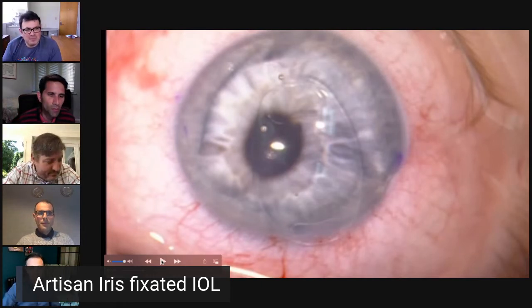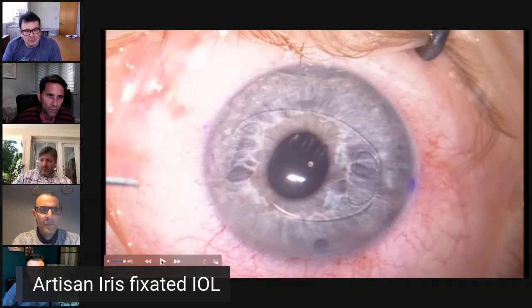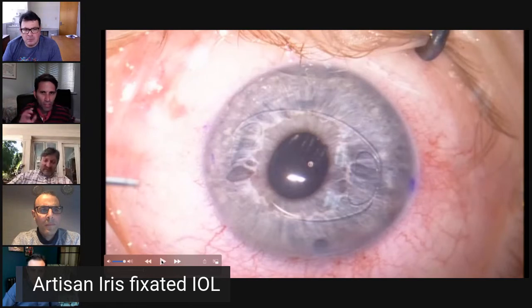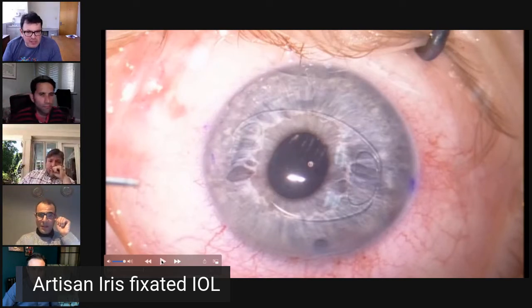I think it's really important. Felipe mentioned in passing that the A constant, when you put it behind the iris, you've got to be careful not to just use the A constant. It's really important when you start not to just assume you order the same IOL as you would if you're putting the iris clip lenses in the front of the eye. Felipe has already mentioned that, but it's a really important point to consider. So we talked about the vault and the IOL calculations. Abdallah, can you please proceed?